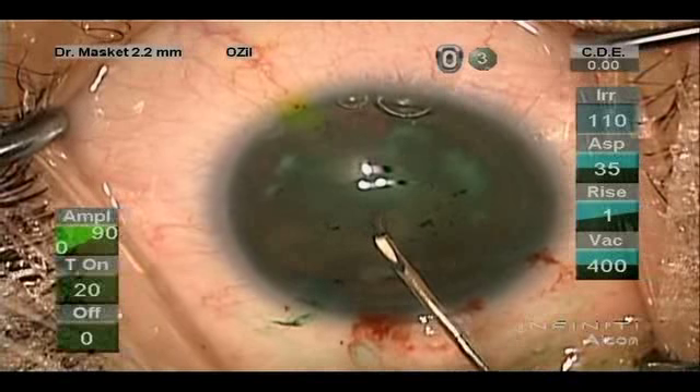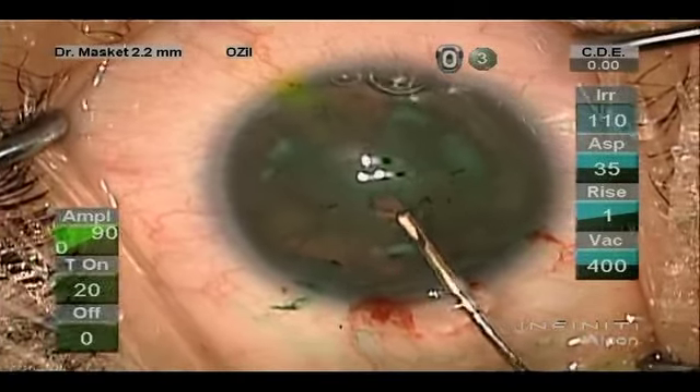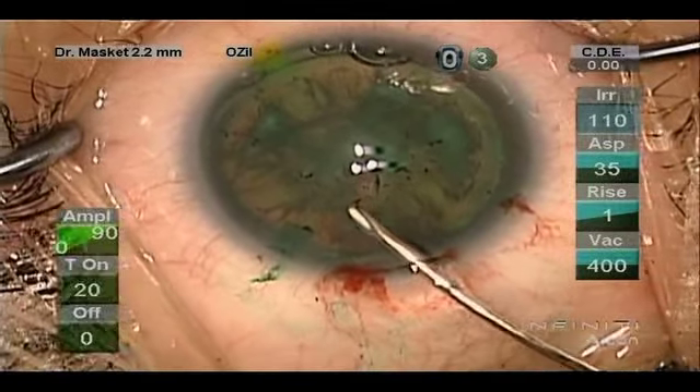We're going to initiate a capsulotomy with the cystotome, and we'll finish it with forceps.